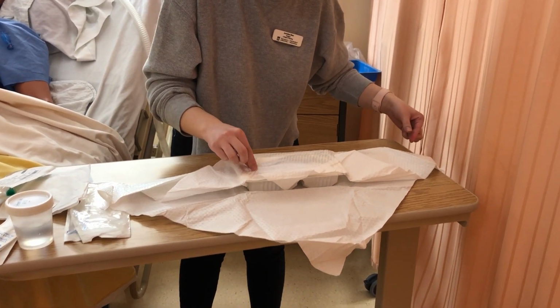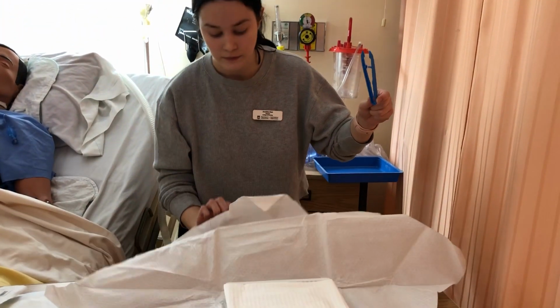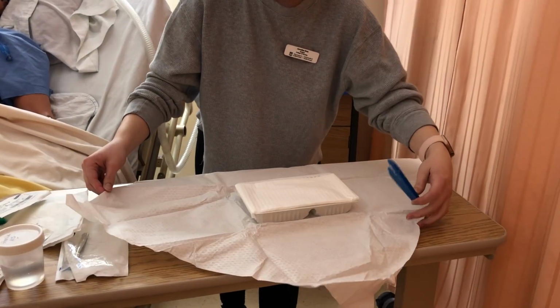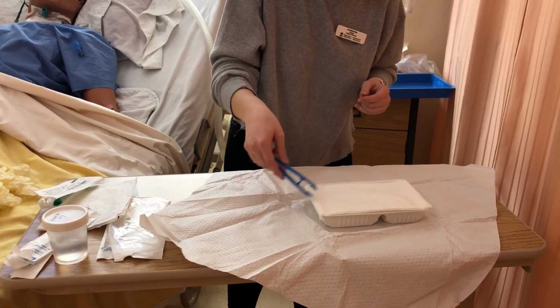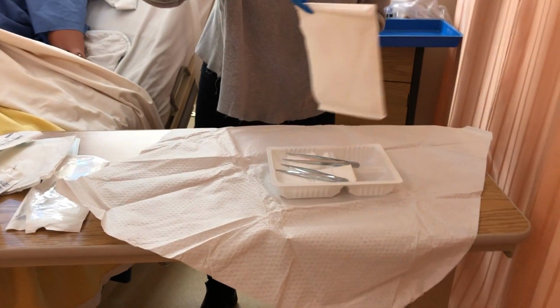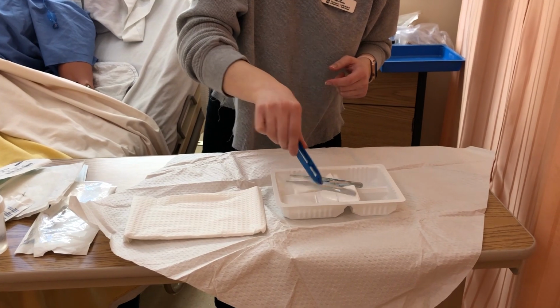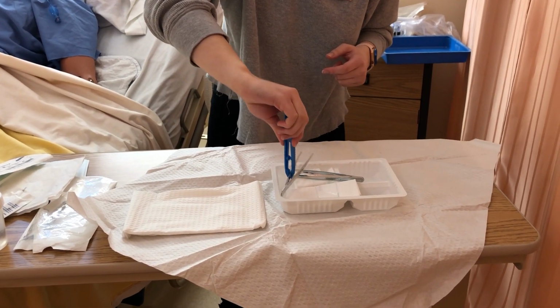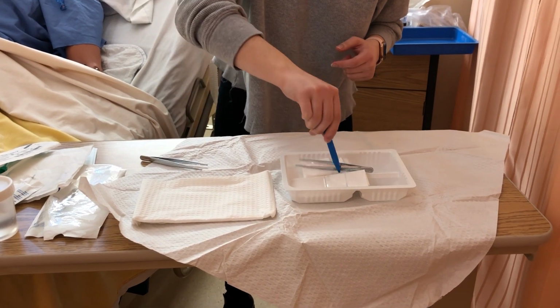I'm being mindful of where my forceps are, so they're right here. I'm using sterile no touch technique, so I'm just going to bring my forceps out.